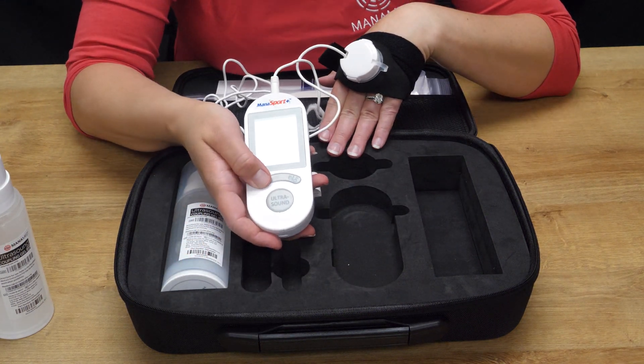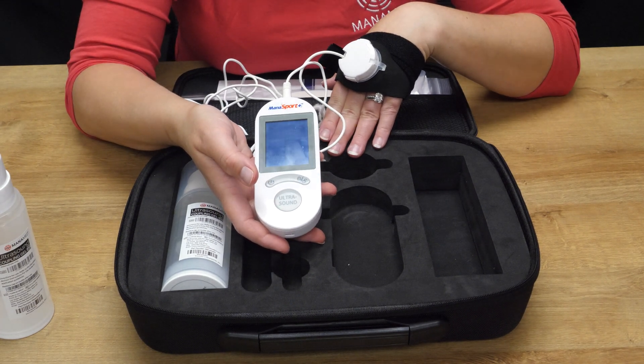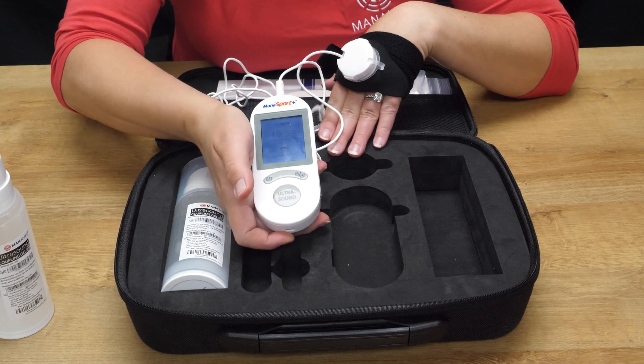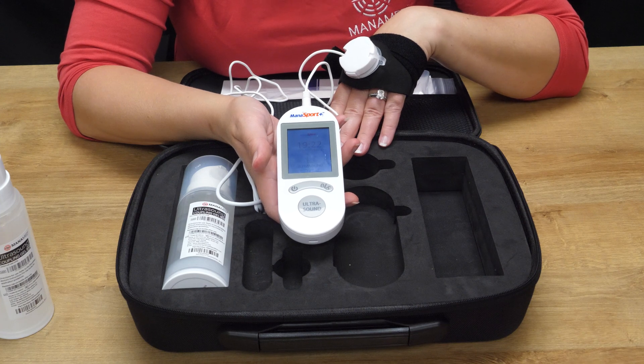This is the power on button. The first screen that will be visible is a calendar to show the compliance of treatment. You'll press the ultrasound button and your 20 minutes will begin. Once the treatment is complete, the monosport will make one beep and automatically turn off by itself.